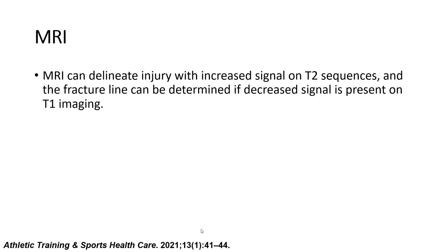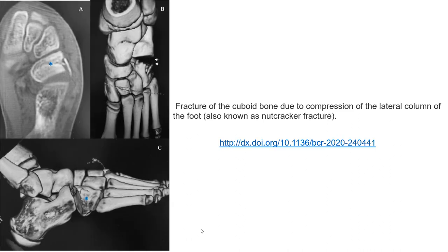MRI can delineate injury with increased signal on T2 sequences, and the fracture line can be determined if decreased signal is present on T1 imaging. This case shows a fracture of the cuboid bone due to compression of the lateral column of the foot, which is known as the nutcracker fracture.